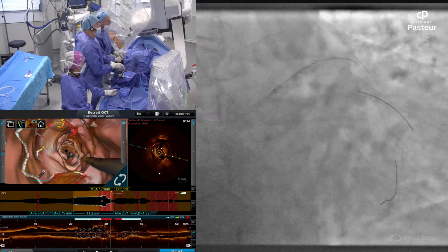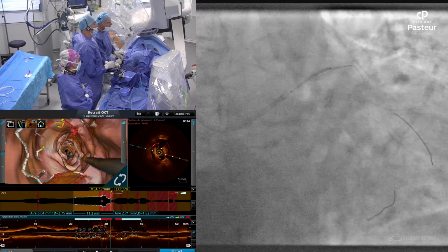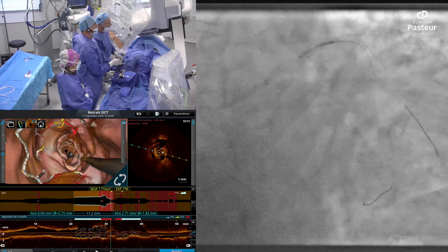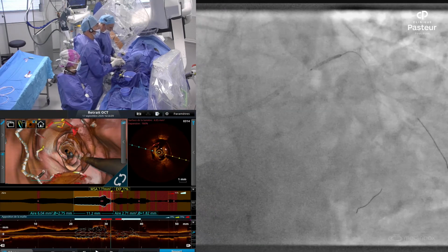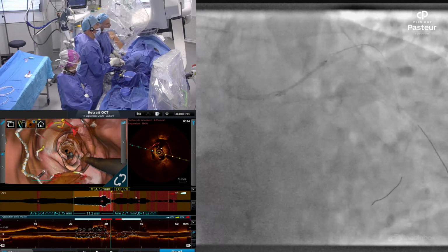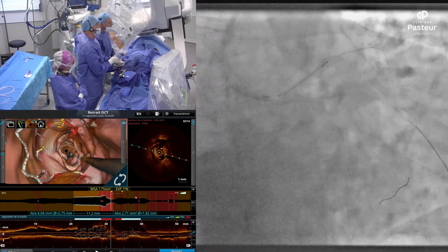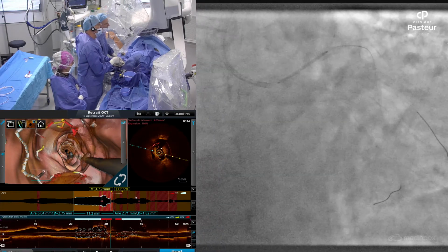Yeah, now you can pull back. And I will disengage the guiding, pushing on the wire. Okay. Sorry, I'm too distal, but yeah, go on. You have time. Okay. Because it's really precise. Okay, we can take a view of that. Okay, let's see.